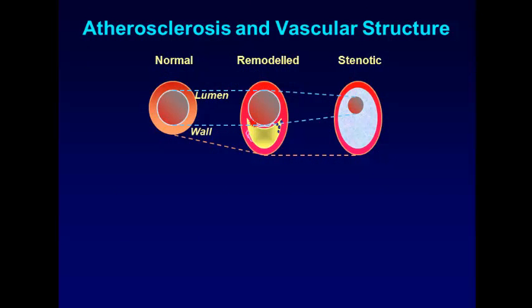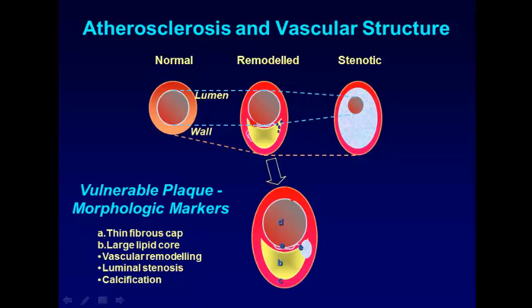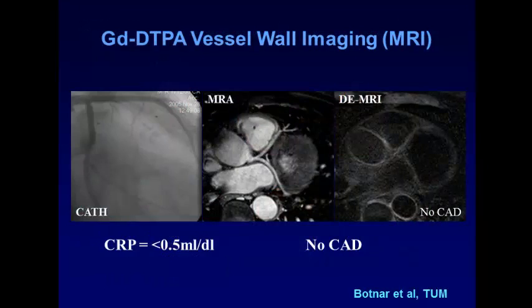So just two words on plaque imaging. Everybody of us knows the cascade from a normal vessel via a remodeled vessel to a stenotic vessel, which is creating vulnerable plaques, which are interesting for us for imaging in order to predict coronary events by different methods.